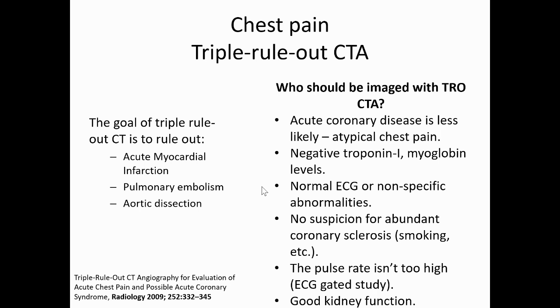And if you're doing a pulmonary embolism CT, then with that, you might not be able to assess the coronary arteries, and vice versa. However, with triple rule-out CT, if available, you can rule out 3 different diseases in just one sitting.